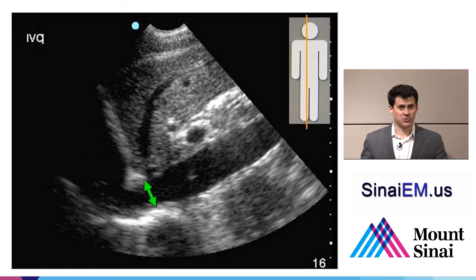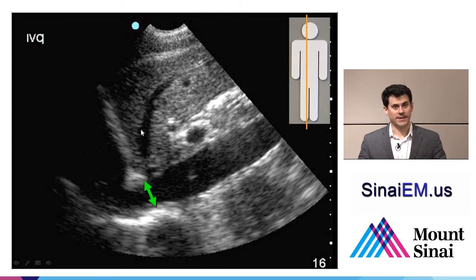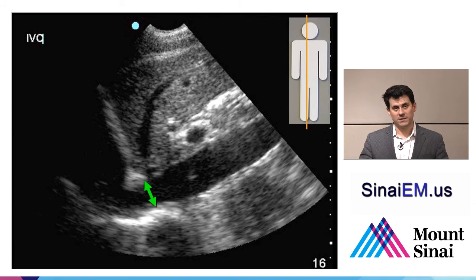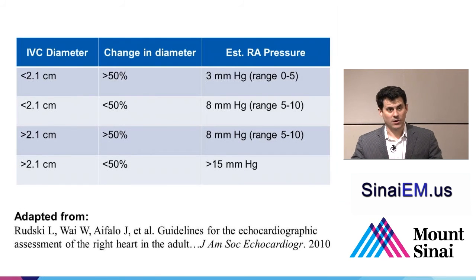More typically, people use a longitudinal view. Find the transverse view, bring the IVC to the middle of your screen, then rotate 90 degrees with the probe marker facing the patient's head. You'll see the liver in the near field, a hepatic vein draining into the IVC, and the right atrium up here. Another way: locate a sub-xiphoid cardiac view, focus on the right atrium, and trace it inferiorly until it opens into the IVC. At the level of the confluence of the hepatic veins, just distal to the right atrium — that's where to measure the diameter.